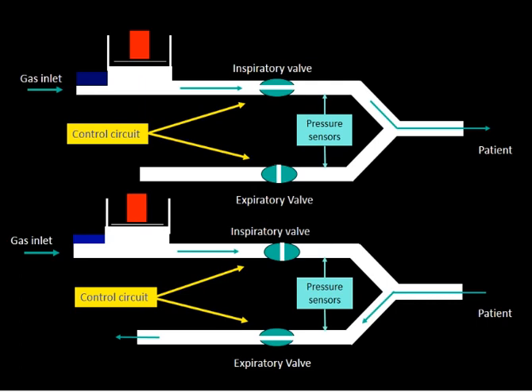Basically, ventilators have different equipment inside, but all of them have an inspiratory branch by which they control the flow being delivered to the patient through an inspiratory valve, and during exhalation there is an expiratory valve that allows the exhalation of the gases. So, as we will see also in pressure control, when we seem to be controlling pressure, what the ventilator is in fact doing is just controlling flow.